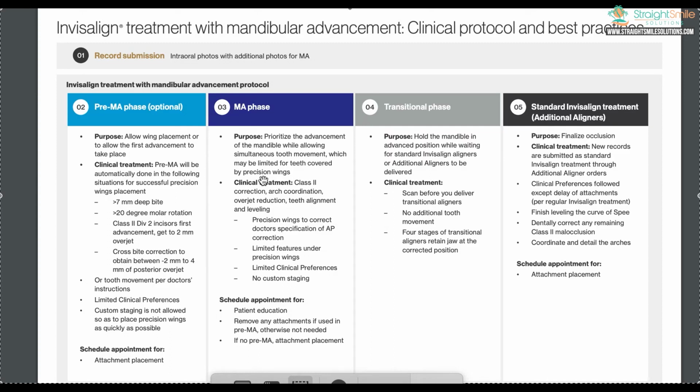For growth modification, there's all kinds of tricks and tips, and for patients that are mouth breathers, it's not so great. They recommend doing all these precision cuts and elastics to loop them tight at night. I don't know. I think there's better and more affordable ways, but always good to have options. So that is kind of my diatribe on the MA. And there's a reason why I don't make that much content about it, because I just don't really care for it.